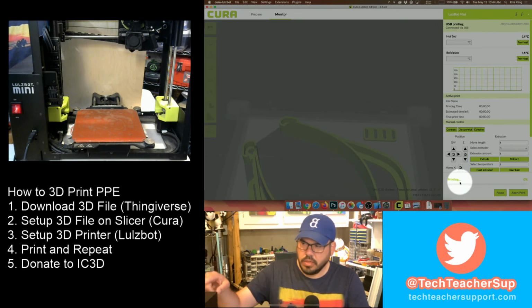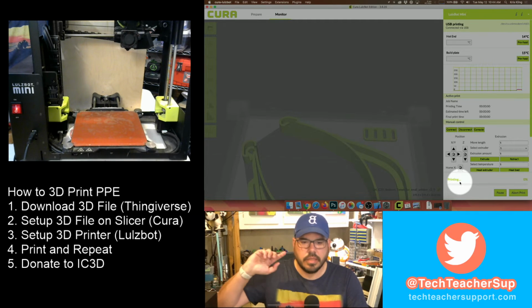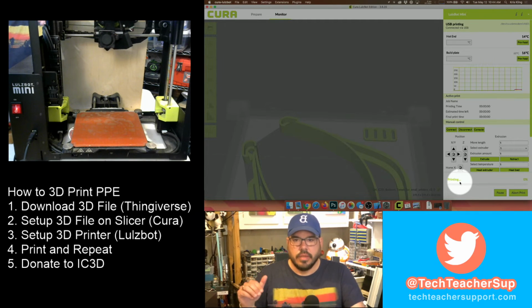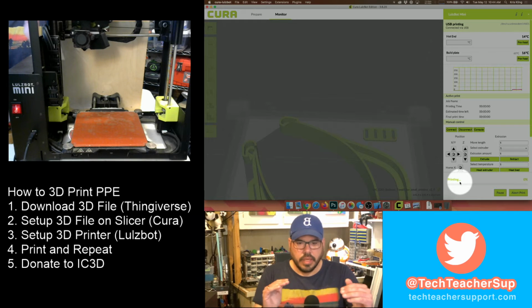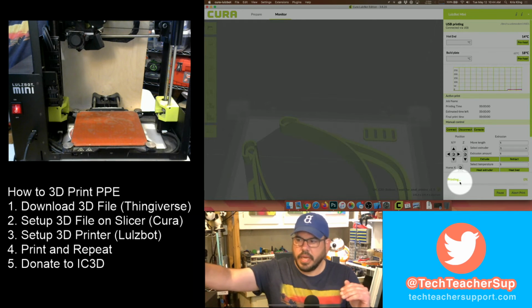Okay, and we should hear this. There we go. It's going to do its calibration, right? So it's going to get everything calibrated and reset to 0. So it's print bed and its nozzle here.